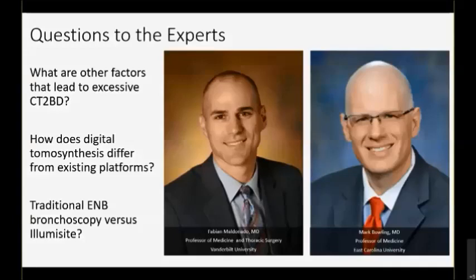So fluoroscopic navigation for me really is the game changer, to be honest with you. Yeah, and I'm going to echo what you're pointing out, which is probably the most important aspect: bronchoscopists in general, whether it's myself or anyone, or the two of you, are excellent at bronchoscopy when we actually know where the target is, or it's fluoroscopically visible or visible by FluoroNav or Illumisite.